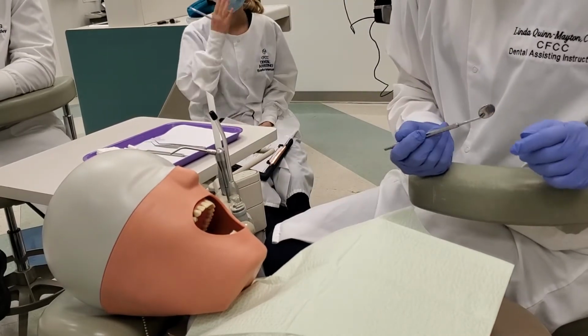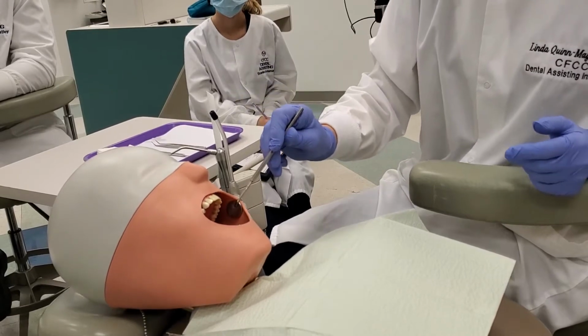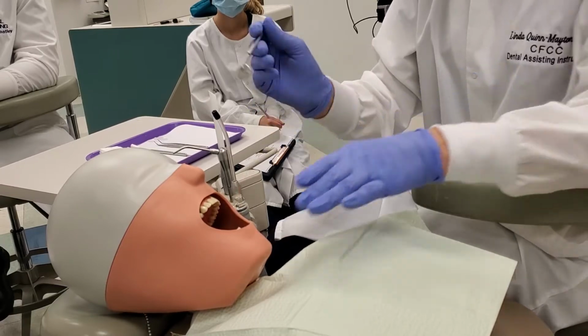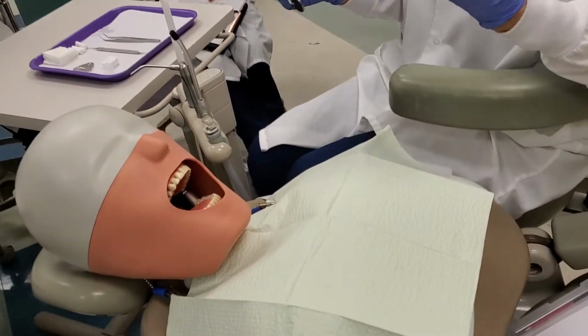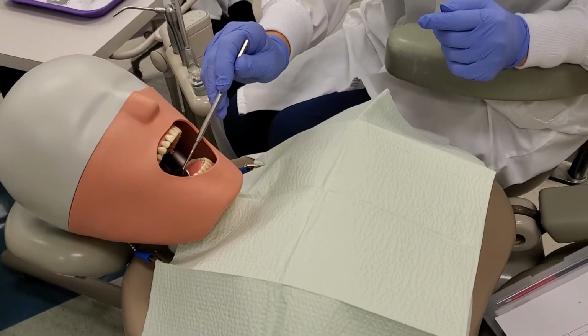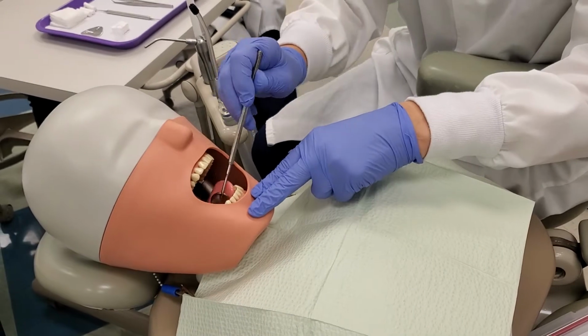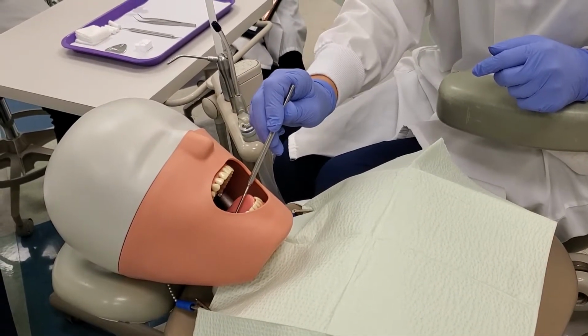Use the mouth mirror to retract the cheek on the left side. Then use the mouth mirror to retract the tongue on the client's right. You're going to be using this to retract that tongue. The tongue is a super strong muscle, and the patient's numb, so they don't know what they're doing. All you're going to do is just retract that tongue, just like that. Okay?